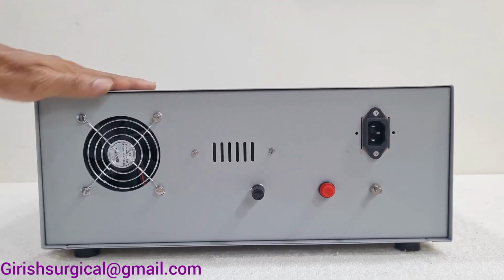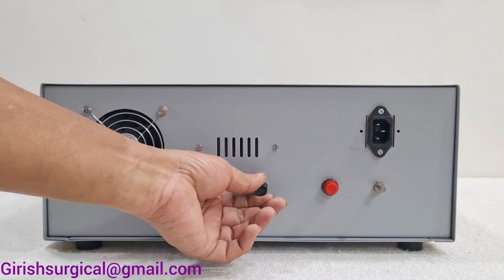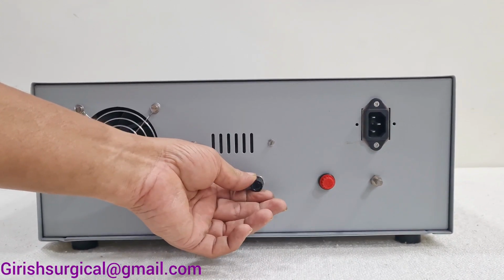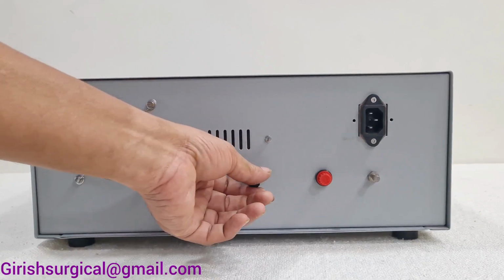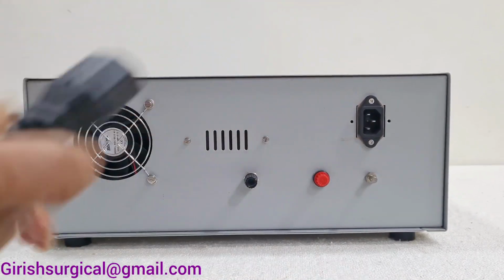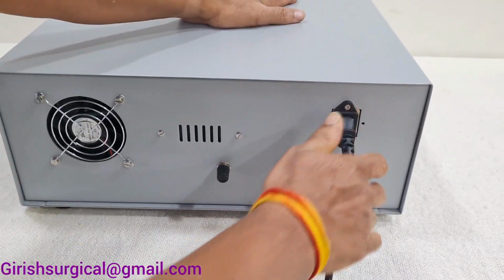At the back part, you will be getting an exhaust fan. This is the volume control. With this you can control the volume, meaning when you use the machine with the foot switch or the hand switch, it will give you the indication that the voice is coming from the machine. Voice means it will give you the buzzer. Like, this is the fuse, this is for the earthing, and here you have to insert the mains cord like this.